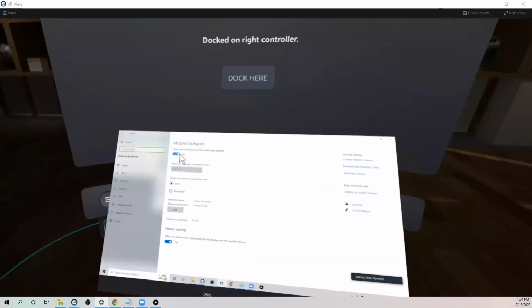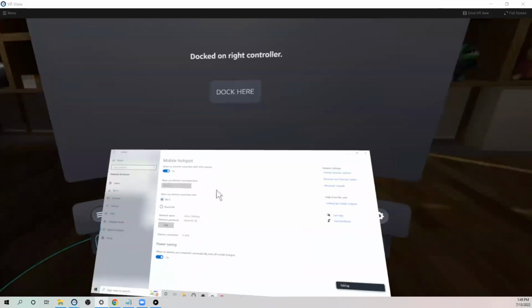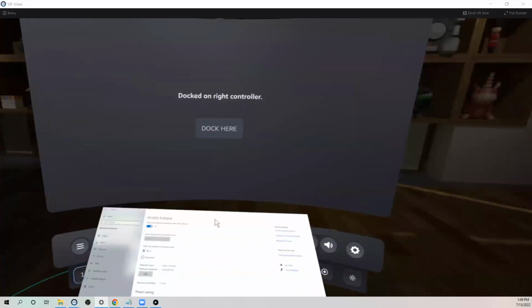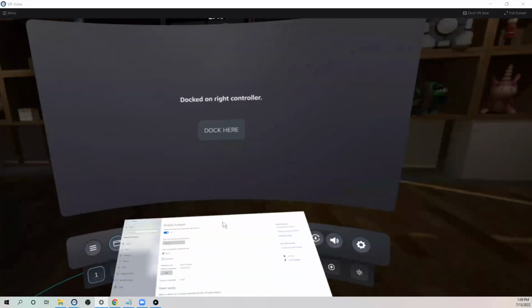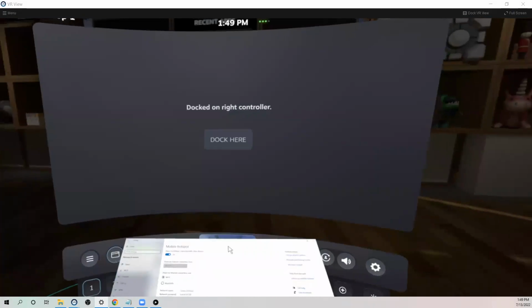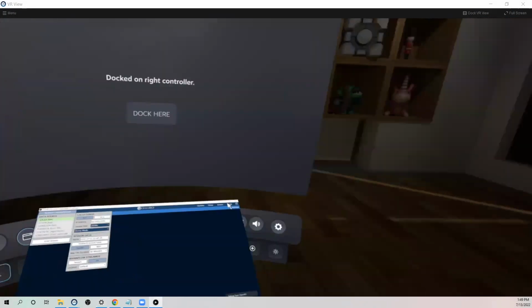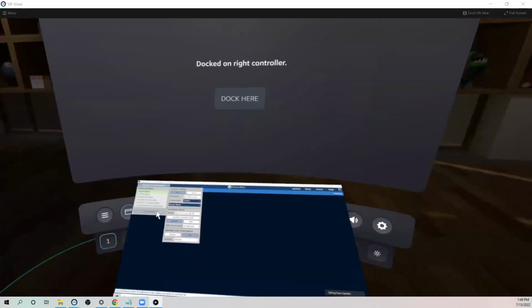It's getting hot. A couple of questions while we're working through it. Actually, I'm going to save the question for LSL towards the end so we can show you in the tool itself. A question from Matthew Boring: how many people have worn a Galea headset, and how consistent is data quality across individuals? Maybe we can talk a little about how many people we've put it on, and if Robert can hear us in the background in the other room, or Connor, you can relay for him.